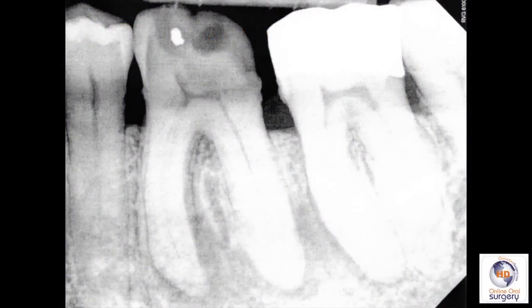Before we take the tooth out, we want to take another look at our periapical radiograph. You can see that there's fairly extensive decay in the crown, so there's always the chance that when you take the tooth out, the crown may crumble. If you look at the roots, there's a fairly straight distal root that does not seem to be decayed, and the mesial root has a little bit of a gentle distal curve on it. There's also some bone loss in the furcation and some widening of the periodontal ligament space.